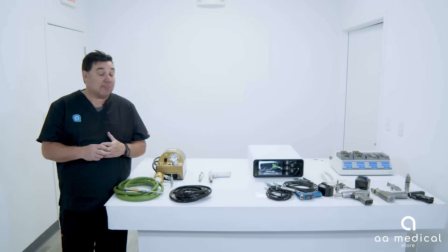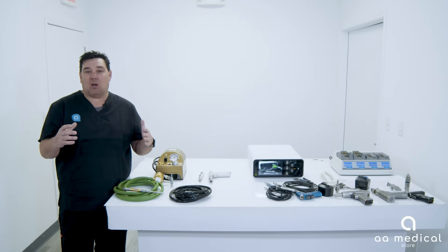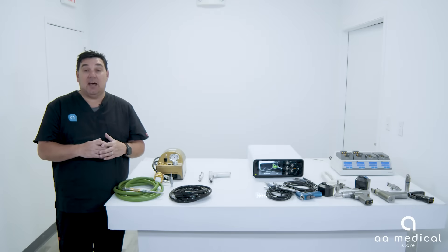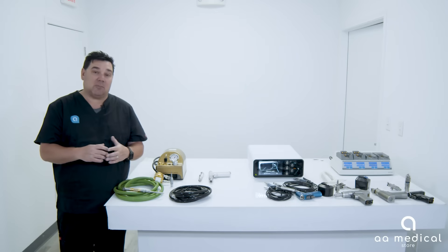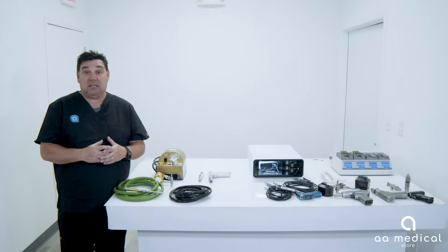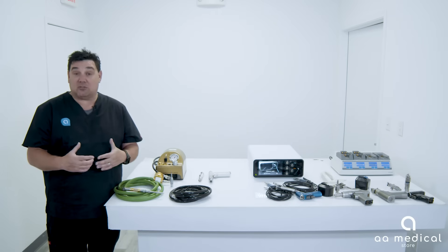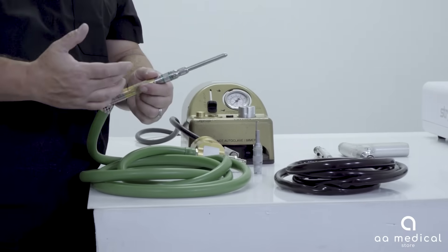On to the final option for power: nitrogen or pneumatic power. It runs off of a nitrogen tank supplied in the operating room, whether it's wall mounted or the big 60-gallon tank that rolls from room to room. The nitrogen powered system gives you a lot of speed and as much torque as the hand piece can take. For this demonstration, we have the Midas Rex nitrogen powered system.